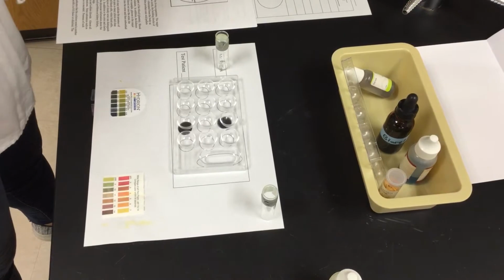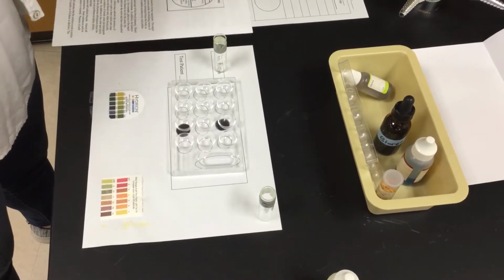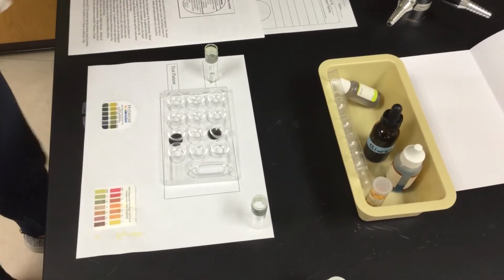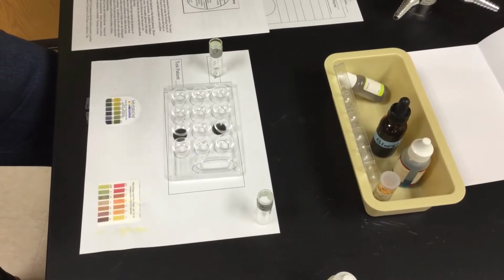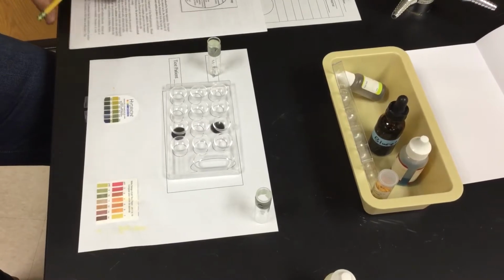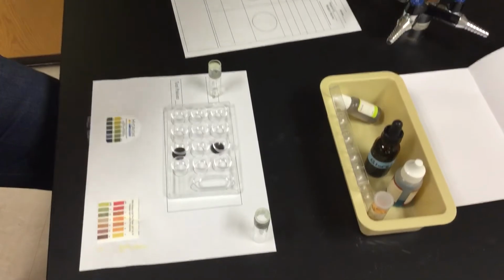The urine that you are working with today is synthetic or fake urine. And what you're going to be doing is testing a control patient, and this control patient is going by the name of Mr. Rollins. He's our control patient because what you're going to see in terms of his test results, they are all completely normal.